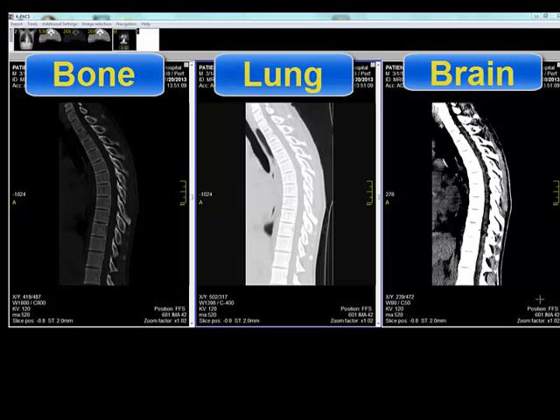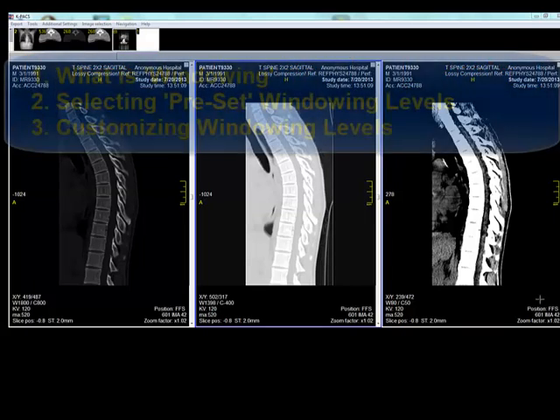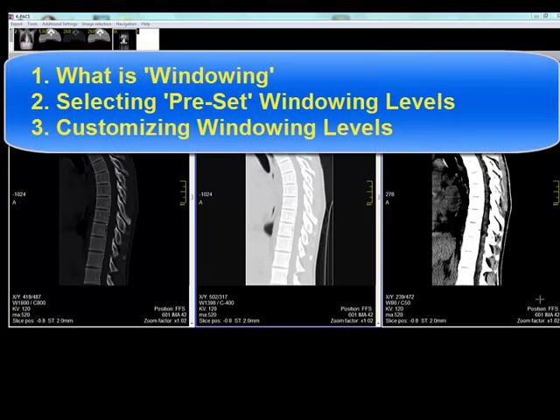In this tutorial we will explain what windowing is and why we use it, show you how to select preset windowing levels, and show you how to customize windowing levels.